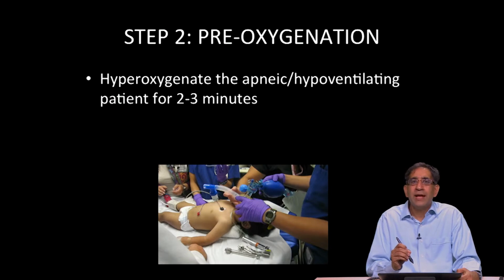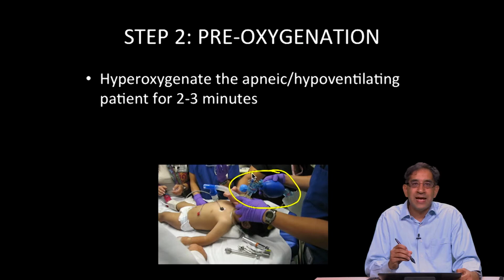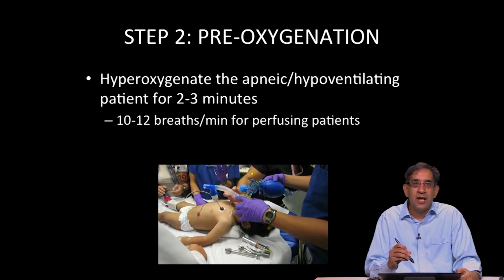There are a couple of ways of doing this. If the patient is hypoventilating, in that case what I mean is they're not breathing adequately or they're not breathing at all, then you need to breathe for the patient with a bag mask device attached to 100% oxygen. And what you're going to do is, if they're an adult, you're going to give them 10 to 12 breaths per minute for 2 to 3 minutes if they have a pulse.